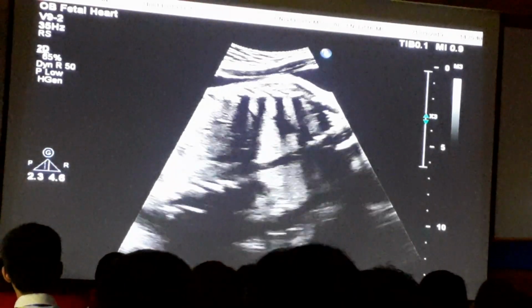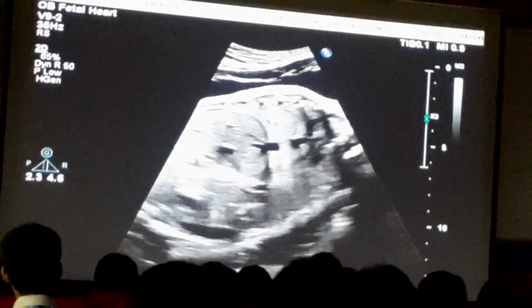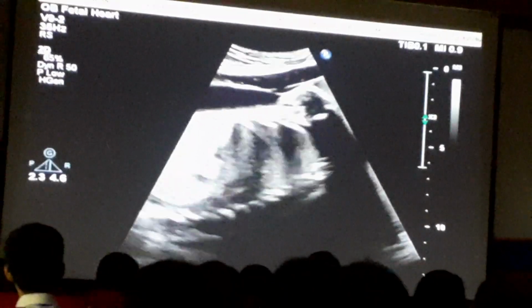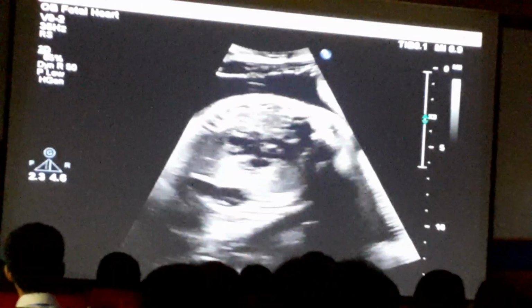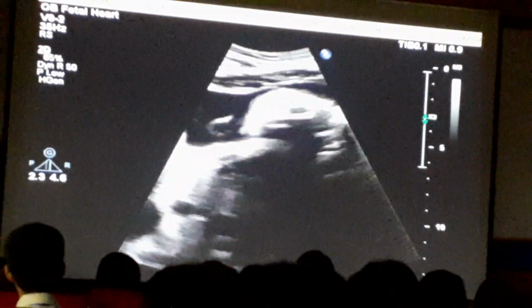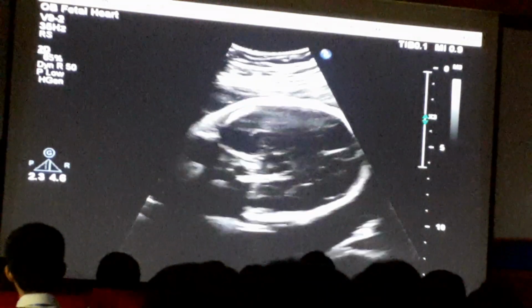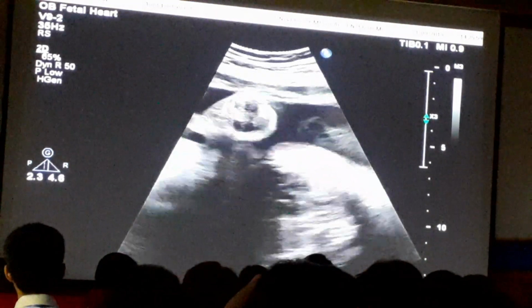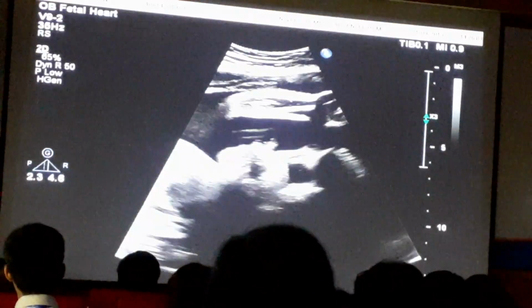So I'm pretty sure that that's what that is, but we want to make sure that it's not some sort of segmental bronchial atresia that can be in the differential, or bronchial compression. Rồi cô nói là cái phổi thì có lẽ mình phải khảo sát thêm thì coi MRI thì nó là cái có một cái phần nào phía bên trái nó bị thiểu sản gì hay không. Nhưng mà về tim thì là như vậy. Mà hôm nay chúng ta đang học về tim.